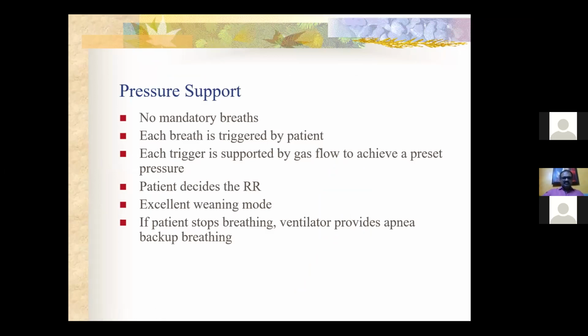Each breath is triggered by the patient, and each trigger is supported by gas flow to achieve a preset pressure. We are setting a pressure support for each triggered breath, and the patient decides the respiratory rate. It is basically a spontaneous mode. It's an excellent weaning mode. This is the mode which we are basically using for weaning any patient now.